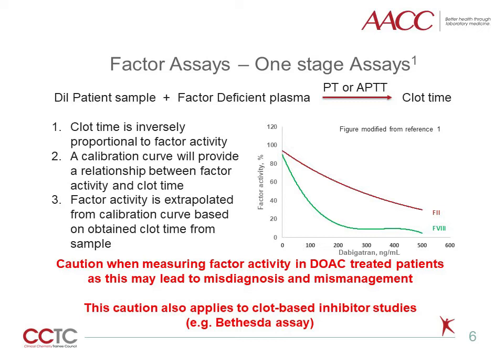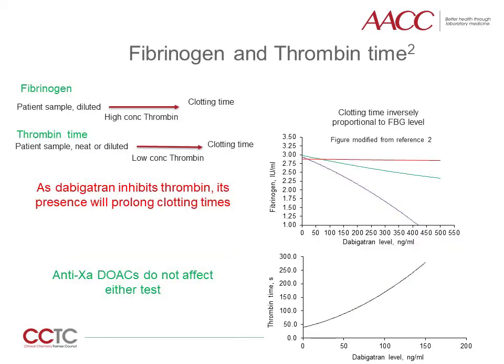This caution also applies to clot-based inhibitor assays, such as the Bethesda assay, which may suggest the presence of a factor inhibitor. Fibrinogen and thrombin time are similar assays in that thrombin is added to the patient sample, where the difference between the two assays is the sample preparation and thrombin concentration. As thrombin is a test reagent, dabigatran, the direct thrombin inhibitor, will prolong clotting time and result in falsely depressed fibrinogen levels and prolonged thrombin time. Direct factor Xa DOACs will not affect either test. The factitiously low fibrinogen levels are dependent on the dabigatran concentration and the testing protocol, including sample dilution and thrombin concentration.